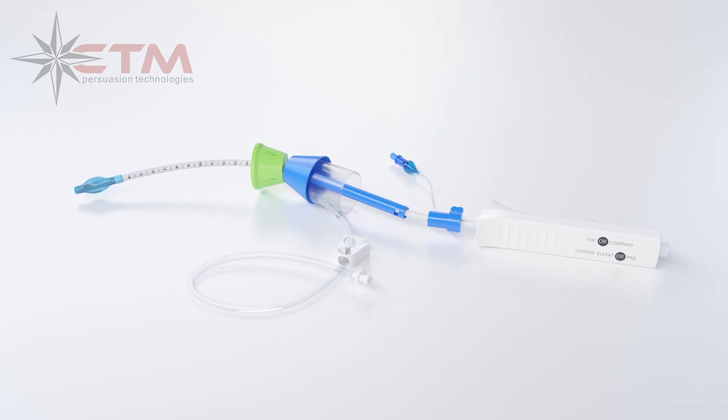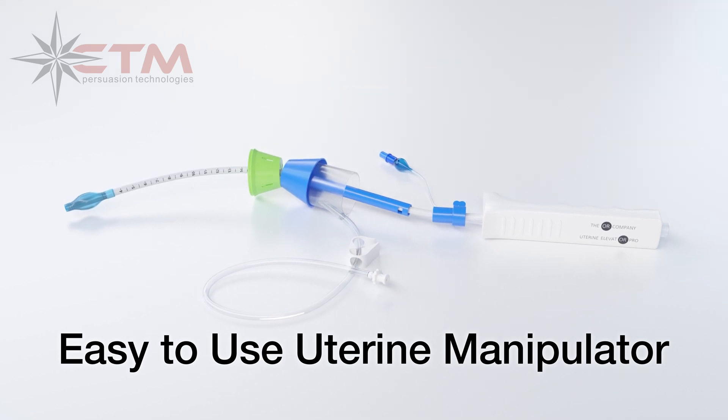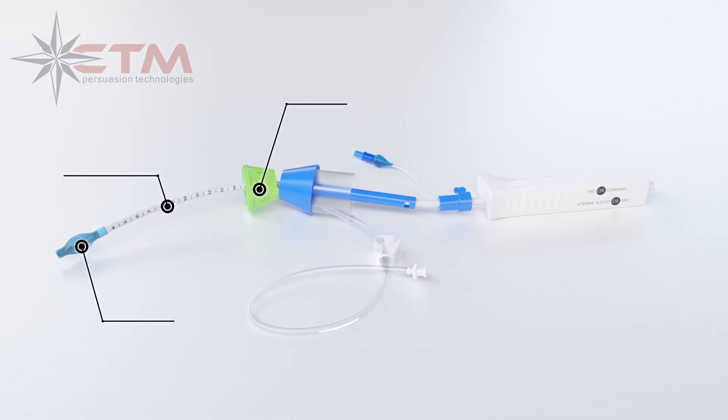Cemetery Surgical presents the Uterine Elevator Pro, an easy-to-use uterine manipulator offering better definition and optimal access to surgical landmarks during laparoscopic and robotic hysterectomies.